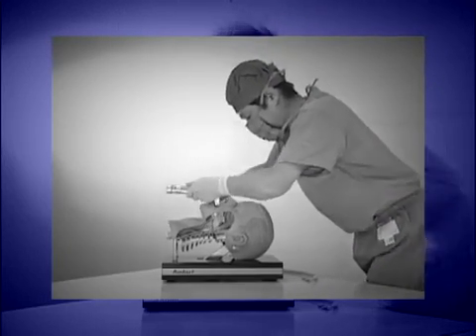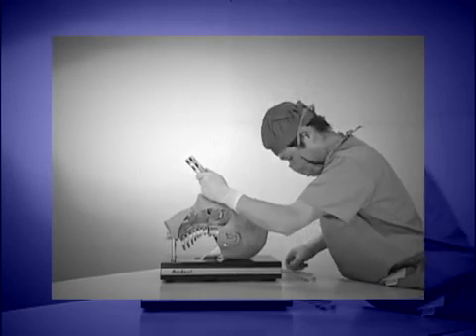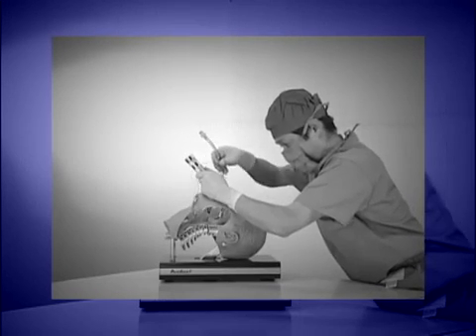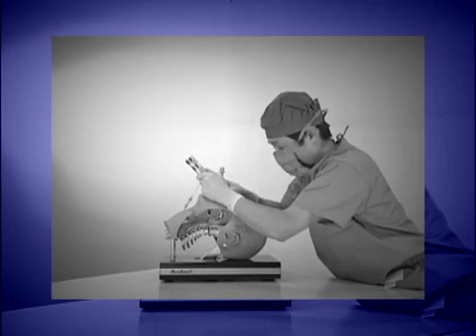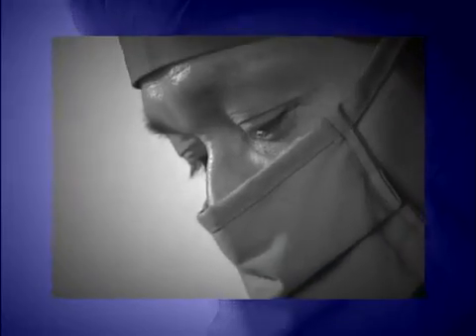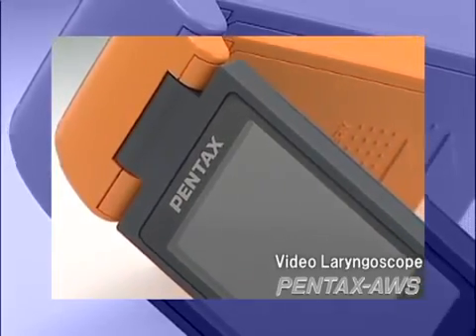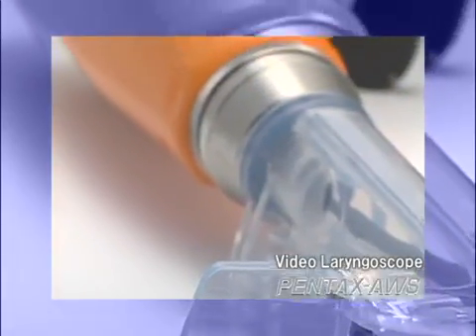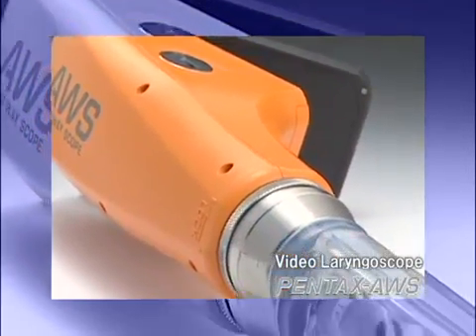Normally, tracheal intubation is verified by direct observation with the eyes. In difficult cases or when visibility is poor, a new device has been needed to monitor and ensure accuracy in tracheal intubation. Pentax has responded with an epoch-making, first-of-its-kind product, the Pentax AWS, a video laryngoscope.